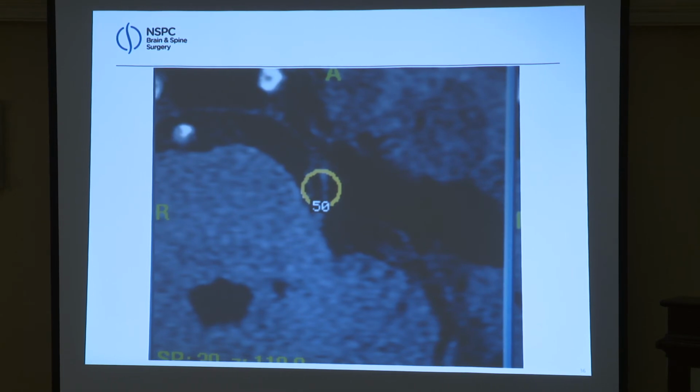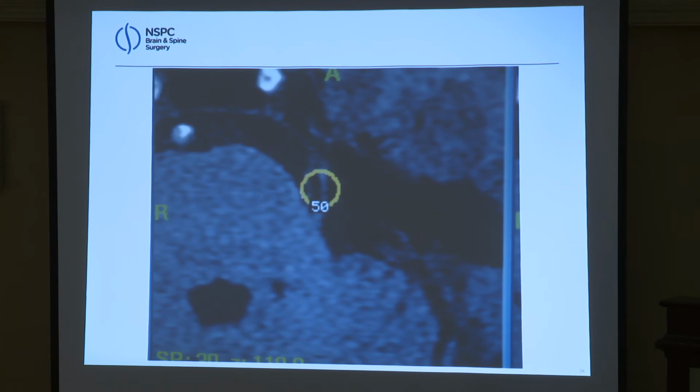Trigeminal neuralgia, however, we're doing quite a bit of, and for people who have had an MVD already, or they're elderly, a lot of these people are older, or they have MS, Gamma Knife can be very effective. This is one of the earlier patients we had. His neurologist had tried like 6 different seizure medicines. The person was just in agony for years, and finally found out about us. We did a Gamma Knife treatment, and within like 3 weeks, the person's pain was gone. They did beautifully. I don't feel you need to try someone on 6 different medicines.